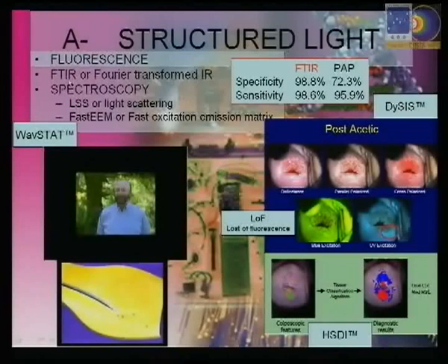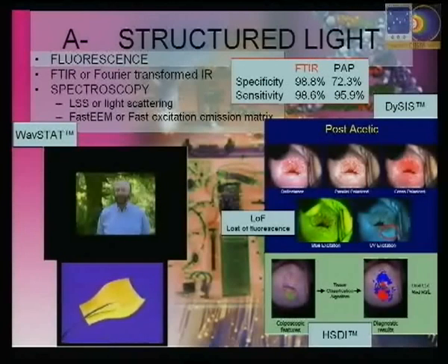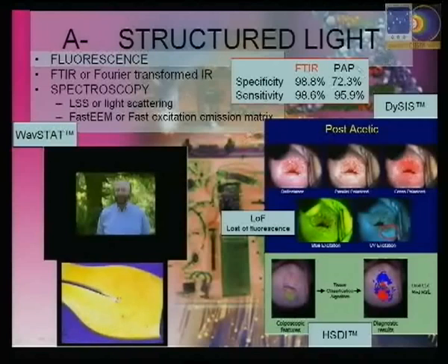This is a very classical use of spectroscopy for detecting malignant areas, and in the cervix and in the bladder and in the colon it gives better specificity and sensitivity than the visual and the histological and the cytological acquisitions.